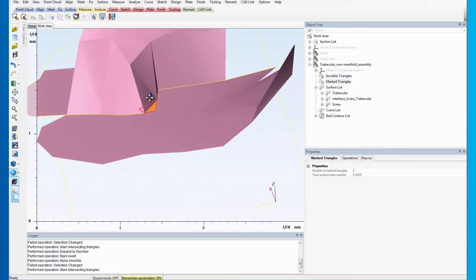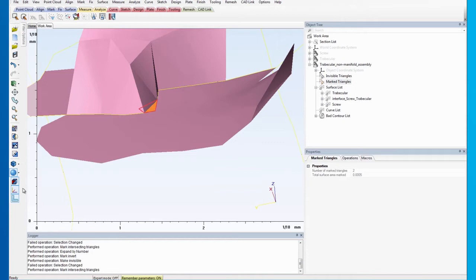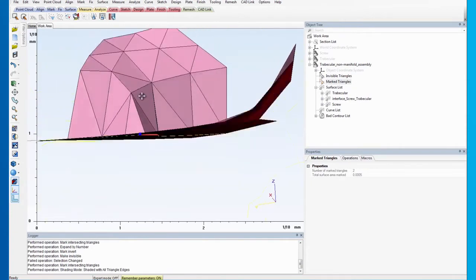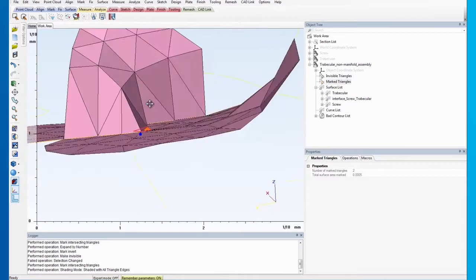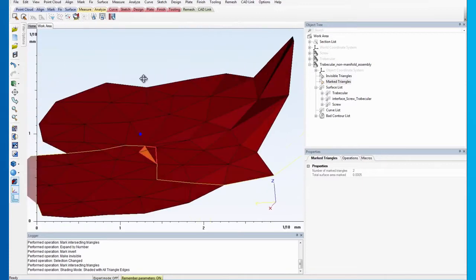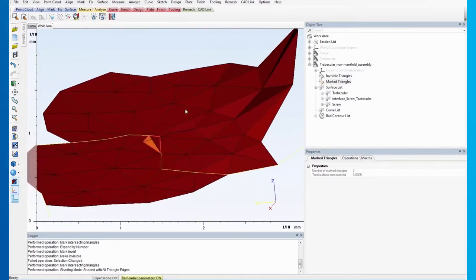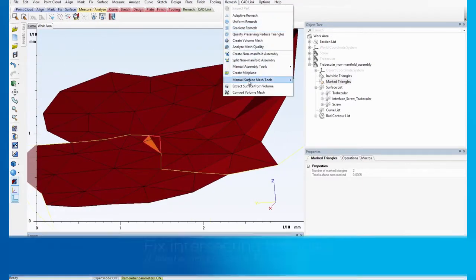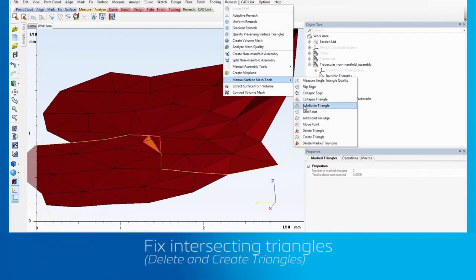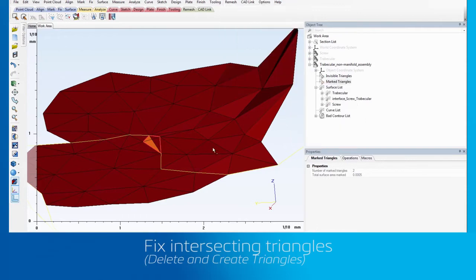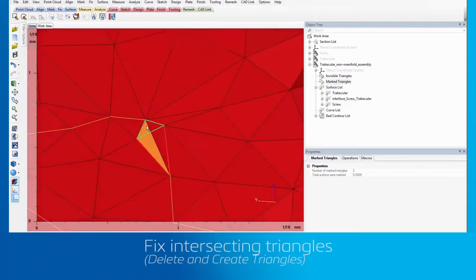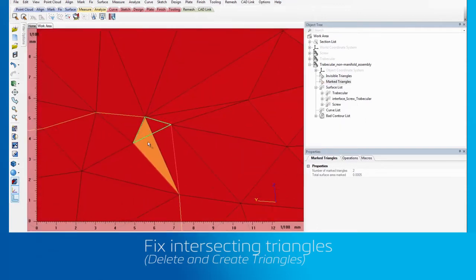To fix the intersecting triangles, we will use the Manual Surface Mesh tool. To make our task a little easier, you can change the Shading mode to Filled with triangle edges. This enables us to see the triangles better. Now, use Delete Triangle to delete the intersecting triangles.